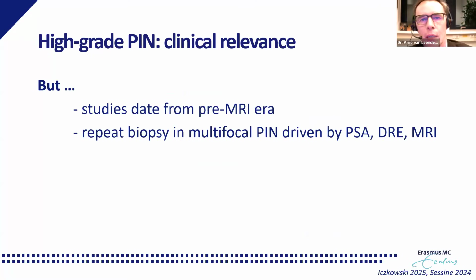So what should we do? How should we report it? Well, it's not clear whether we have to report unifocal high-grade PIN, because generally it doesn't have any increased risk for finding cancer at the repeat biopsies.